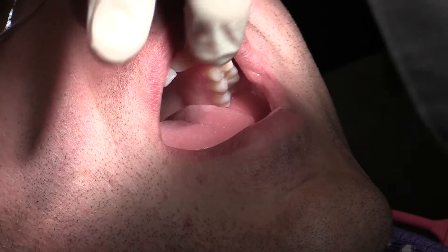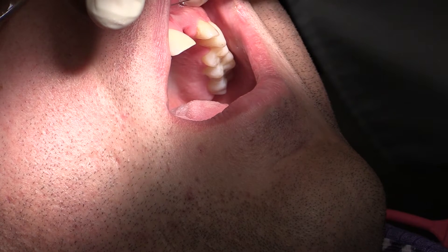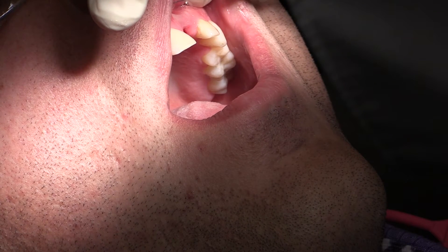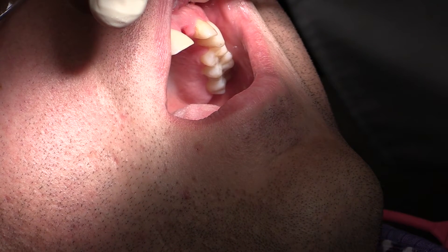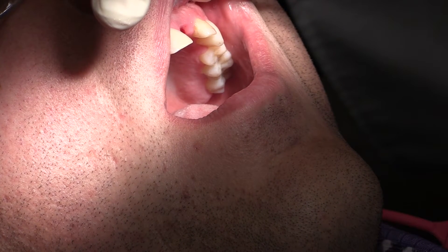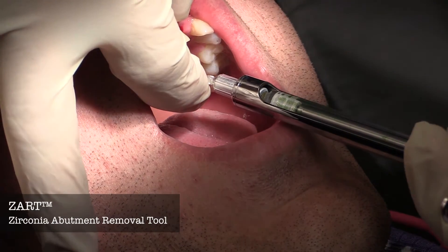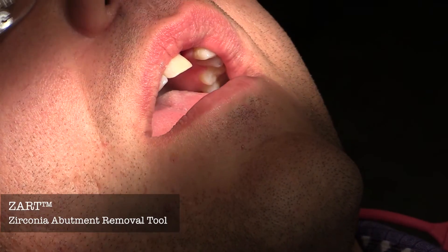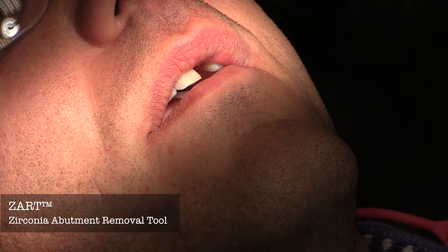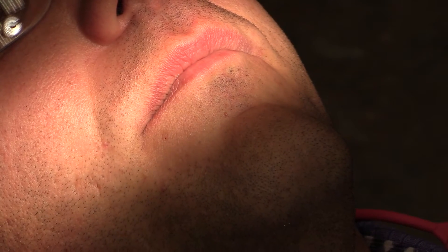This can be very difficult to get out because what ends up happening is there's a conical connection on that hex, just above it, that gets locked down inside. And then the hex itself gets locked down inside, so it becomes a difficult task to get out unless you have a special tool developed by Steve Hurston called the ZART. ZART stands for Zirconia Abutment Removal Tool. The piece of zirconia can be very difficult to get out because it does get locked down into the conical connection.